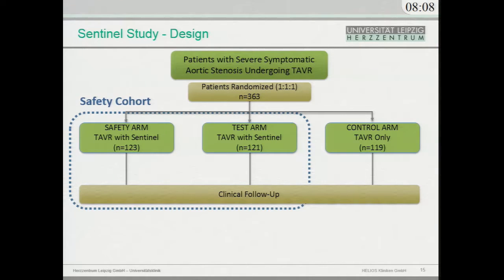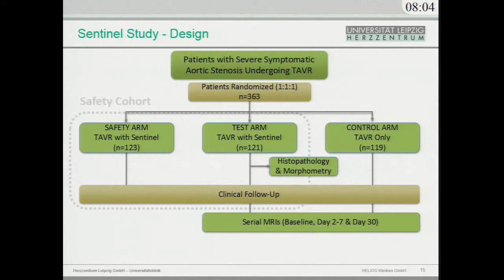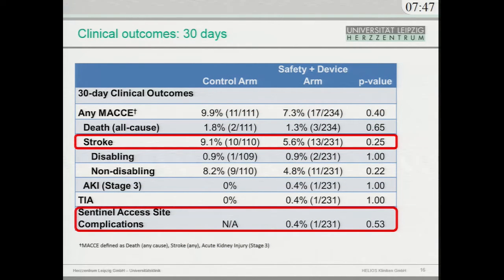Clinical follow-up was the same for all of these patients, and there was histopathology and morphometry performed in all of these patients. And of course, in the 2 groups, there were serial MRIs obtained after implantation. And there was also a neurological workup done by a neurologist, which is very important.